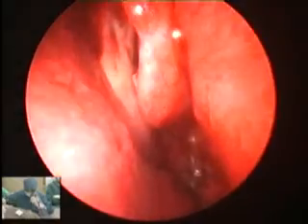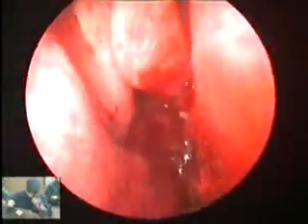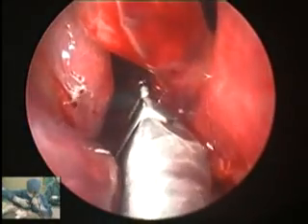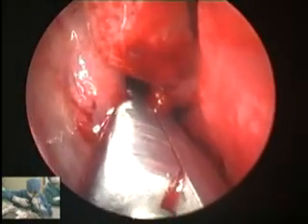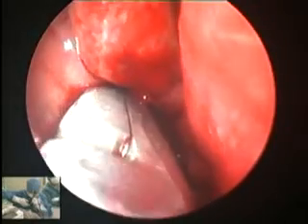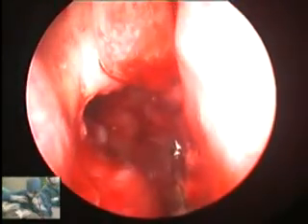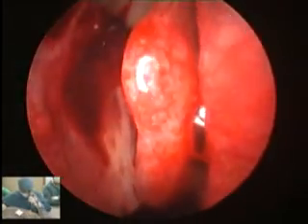Okay, backbiting process. Now I insert the backbiter. This is the big backbiter. This is the traditional old big backbiter. Get into the infundibulum. Take the first cut, second cut, rotate a little bit. A good rotation there with the third cut. It's very important. Okay. A curved probe. Suction.